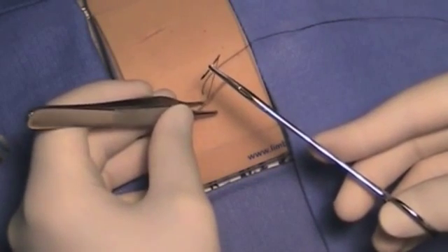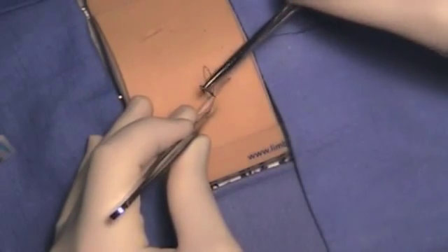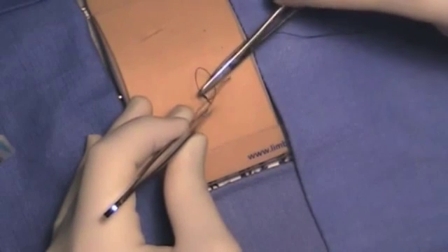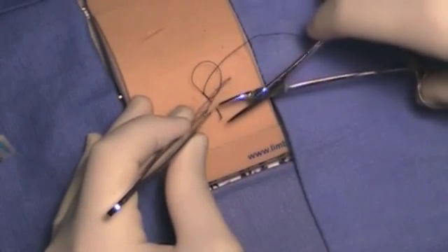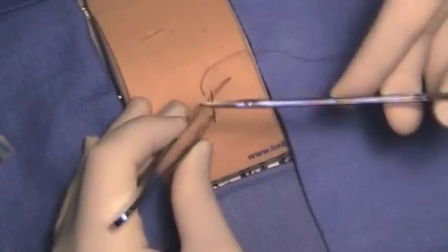The student should be expected to do two separate bites. Re-insert the needle at 90 degrees and you should exit the skin two to four millimeters away from the wound edge. Again, twist the needle until it's fully out of the skin and then pull the suture material through until there's about three to four centimeters left on the short end.